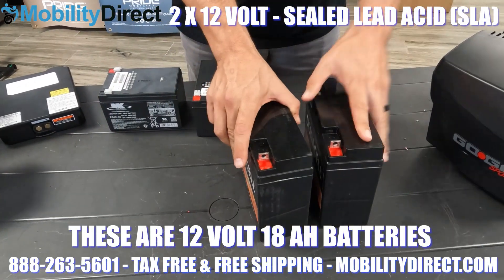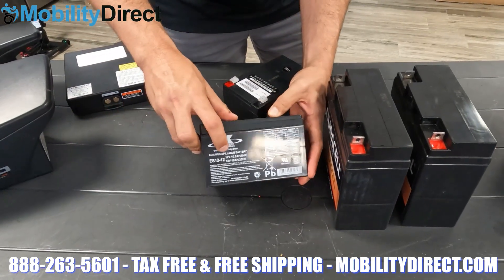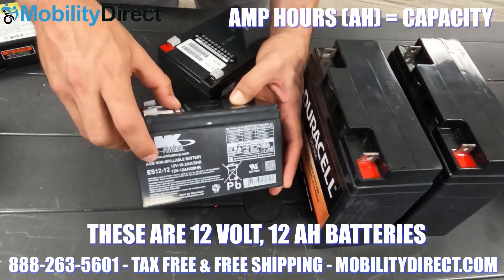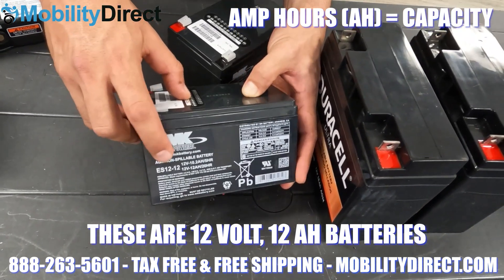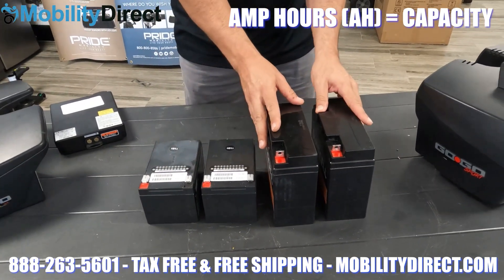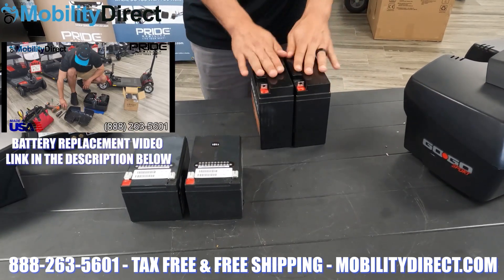We also have other videos that show you more about understanding different types of batteries, battery voltage, battery capacity, and how to find the right batteries for your mobility scooter or power wheelchair if you need to replace them. So if you want to learn more about batteries in general, click on the top right hand corner of the screen where it says battery tutorial video.